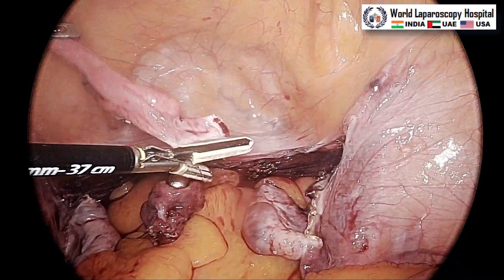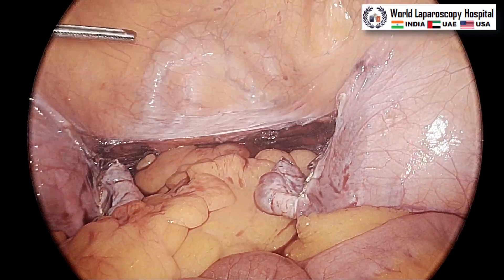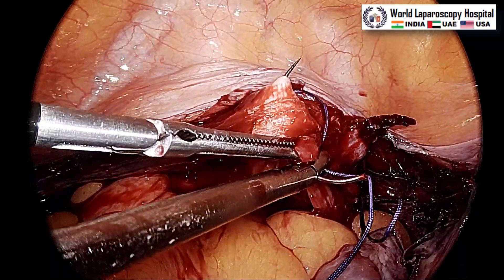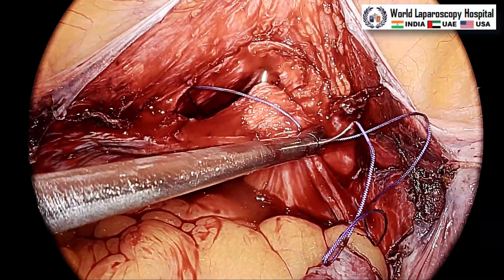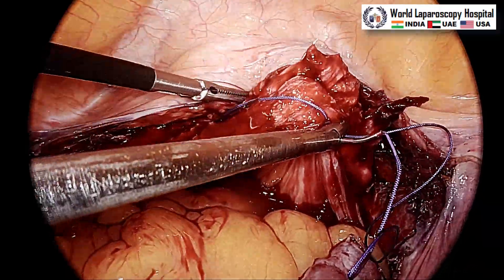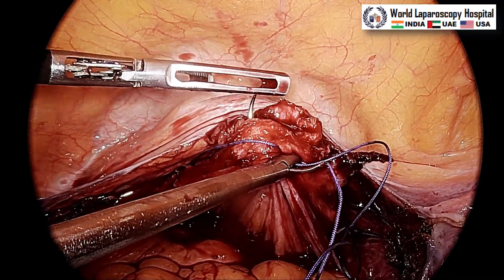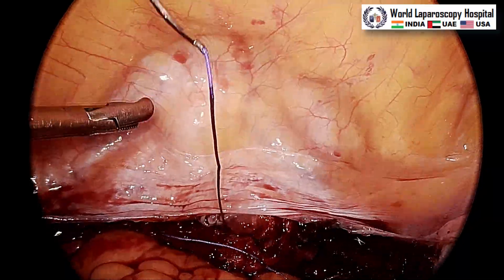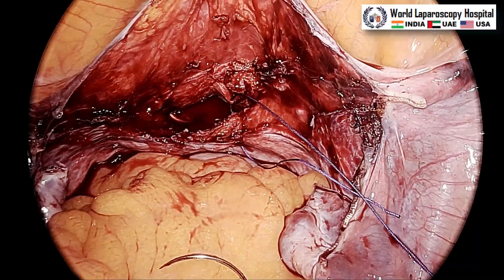Better to use the harmonic for this process because it has minimum collateral damage. Both tubes are now taken out. The suture is pushed through the vagina and now we proceed to closure — we do a double layer closure. In the first layer we do not lock and we do it loosely without locking. This is a three-port surgery; most hysterectomies we perform with only three ports — one supraumbilical port and two ipsilateral ports 18 cm away from the target, which is the uterine artery.